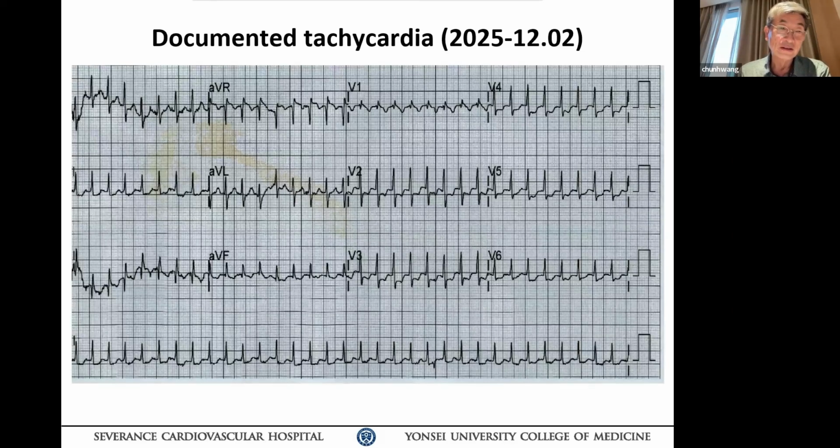Okay? Yeah, that's a short RP tachycardia. The retrograde P is very short, so this is suggestive of AVNRT. A little bit longer would suggest AVRT, but obviously non-diagnostic. So you can always put a differential diagnosis first, this, second this, and so on. We are trying to make you guys think, open your mind, make a differential diagnosis. EKG is never diagnostic, only suggestive, so you need to make a differential diagnosis. Next slide, let's take a look at that.